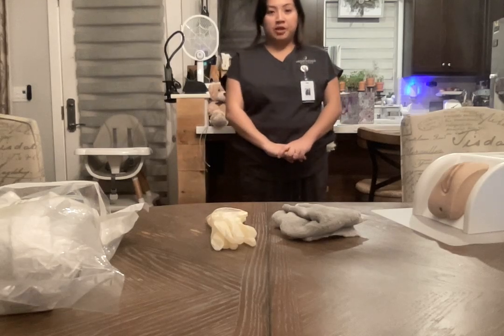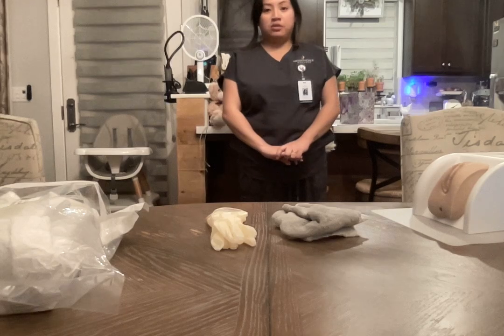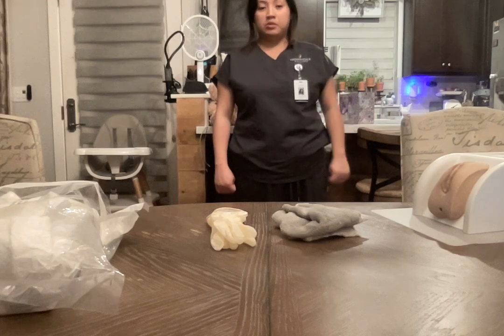Hello, my name is Catheter and I will be doing the insertion of Foley catheter video, and I'm wearing my Nightingale scrubs and badge, and then I have my supplies with me.